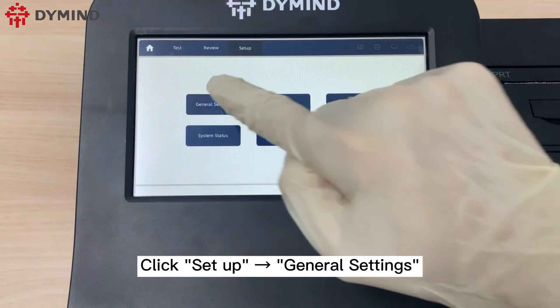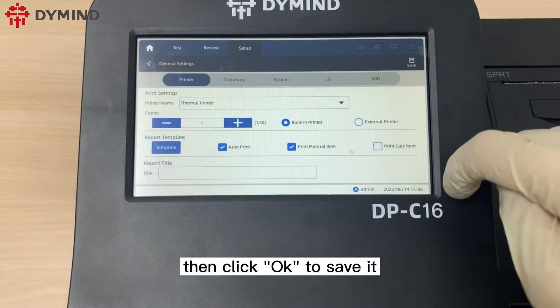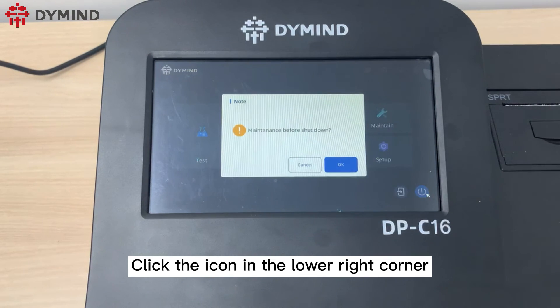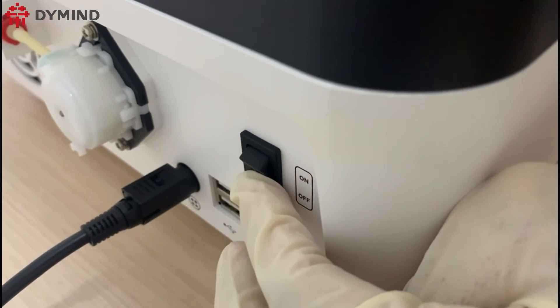Click setup, then general settings, then printer to select the printer template. Click OK to save it. Click the icon in the lower right corner, then wait for several seconds, and press the power switch to turn off.